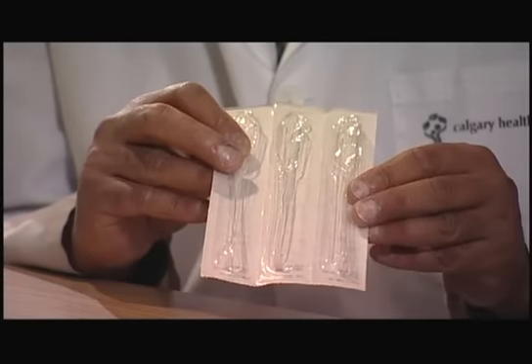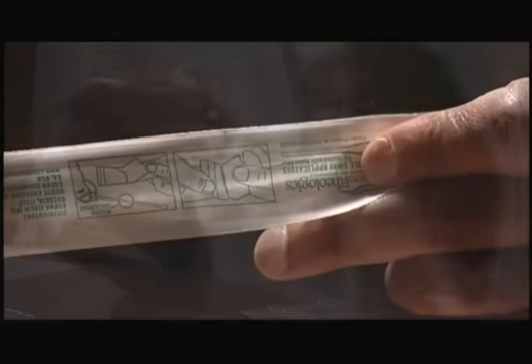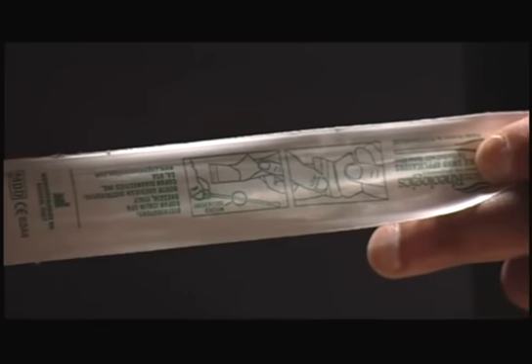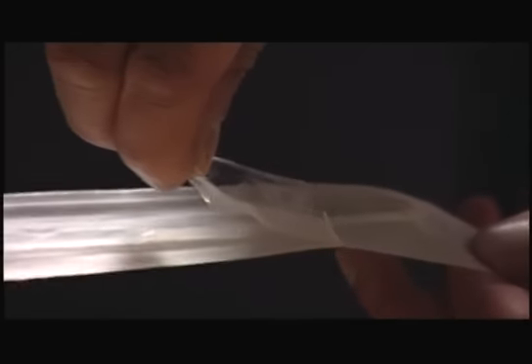These are the nasopharyngeal swabs, which come in packages. Each swab is separately packaged in a sterile blister wrap, and the swab should be stored at ambient temperature away from the sunlight or other heat sources. The expiry date is located on the base of the swab, and swabs should not be used past this date. There are different parts to the swab. Open the container where it says "Peel here," which is the side away from the collection end.